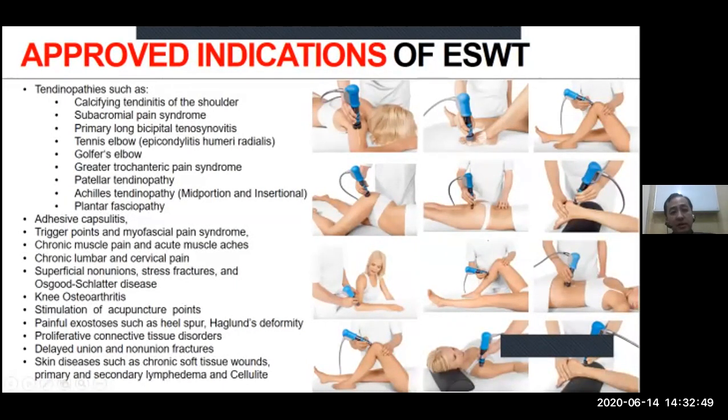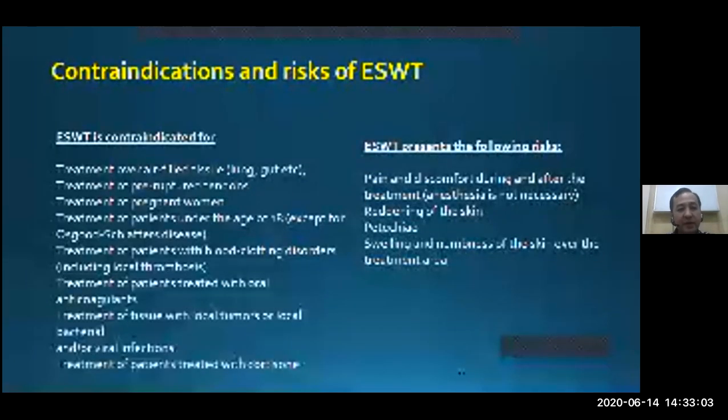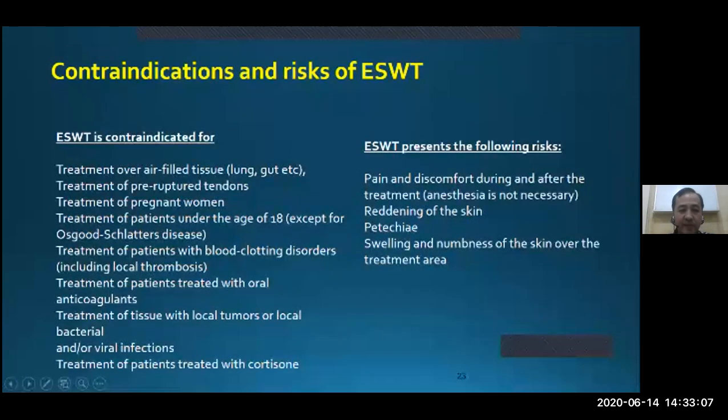And how about the contraindications and risks of shockwave? Actually, shockwave has no absolute contraindication, but there are some contraindications: treatment of air-filled tissue like lung, gut, etc., and treatment of pre-rupture tendons. This is very important in the musculoskeletal system.